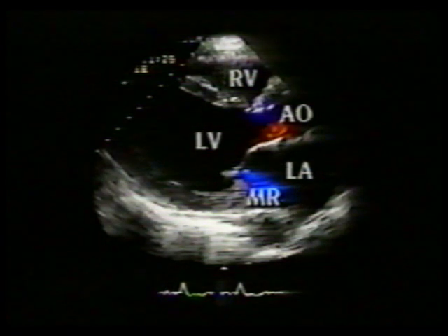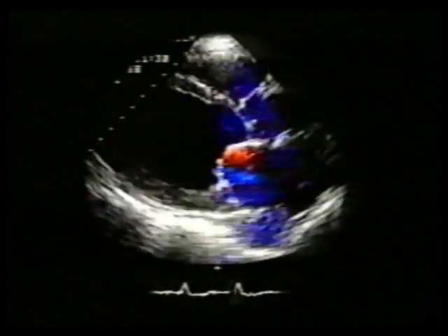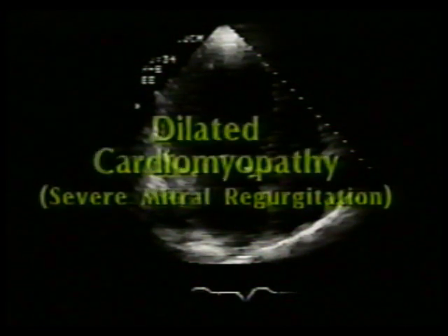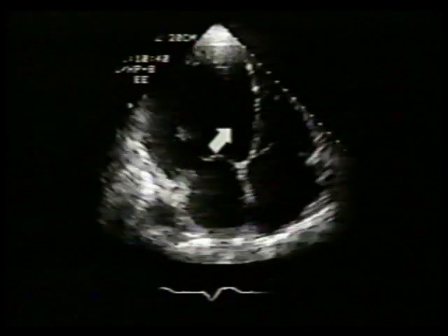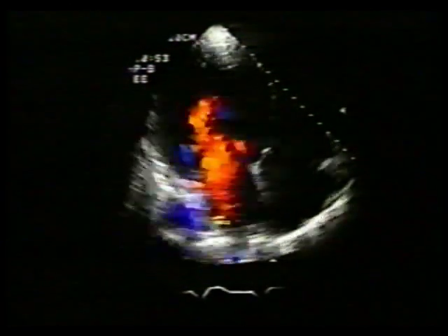This 77-year-old female has an ejection fraction of 27%. Note the jet of mild mitral regurgitation. This patient with dilated cardiomyopathy also has severe reduction in LV function. In this case, mitral regurgitation is severe. The broad color jet nearly fills the left atrium.